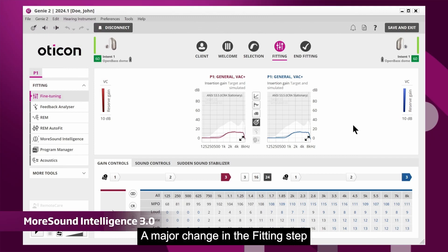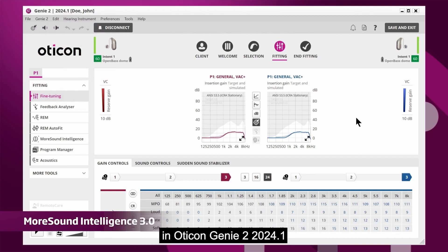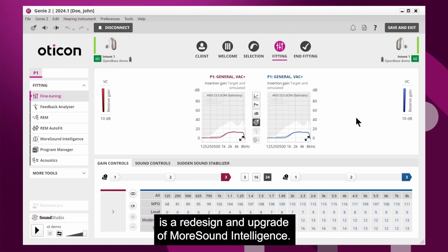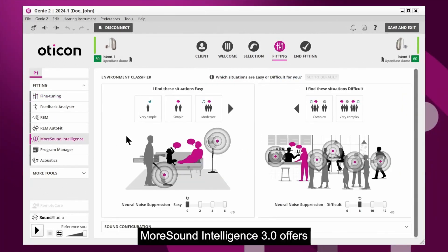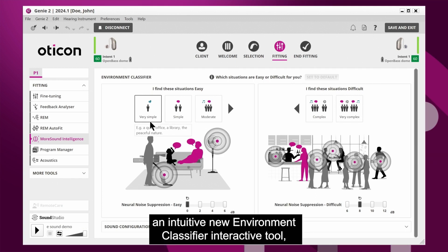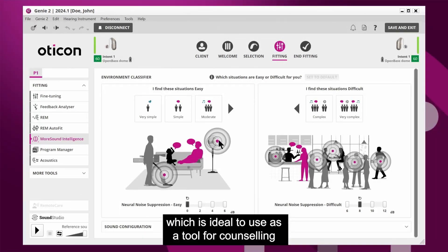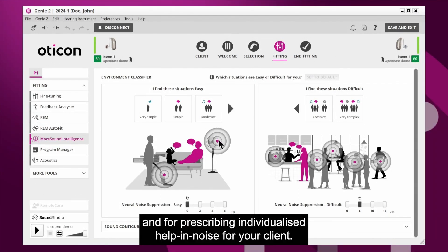A major change in the fitting step in Oticon Genie 2 2024.1 is a redesign and upgrade of MoreSound Intelligence. MoreSound Intelligence 3.0 offers an intuitive new environment classifier interactive tool, which is ideal to use as a tool for counselling and for prescribing individualised help in noise for your client.